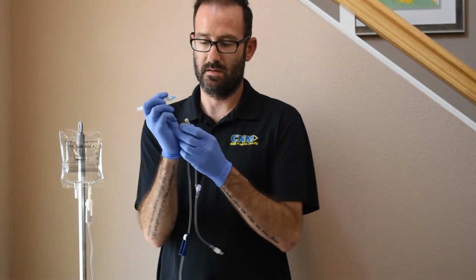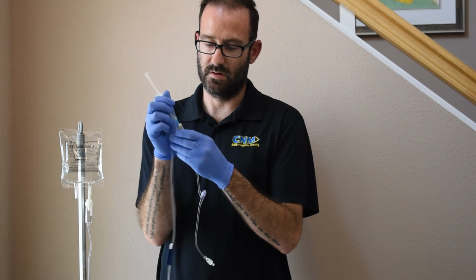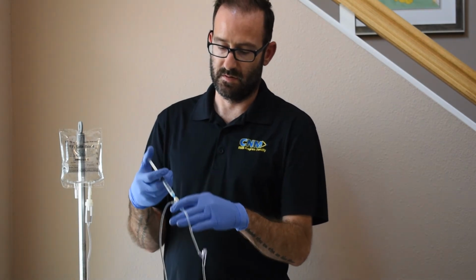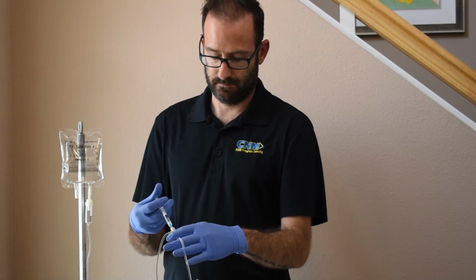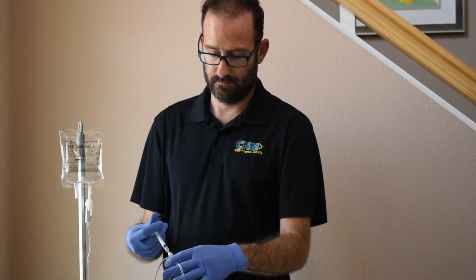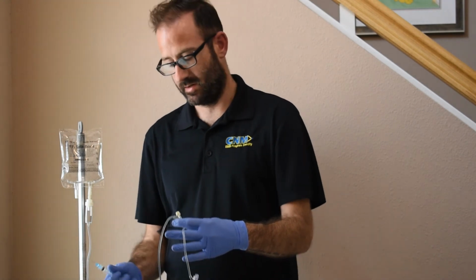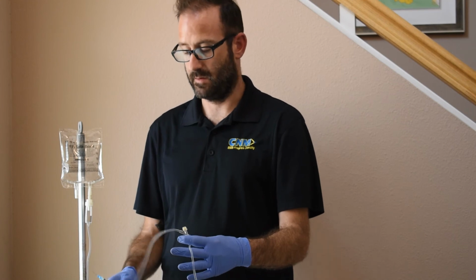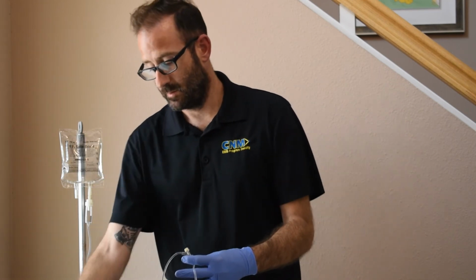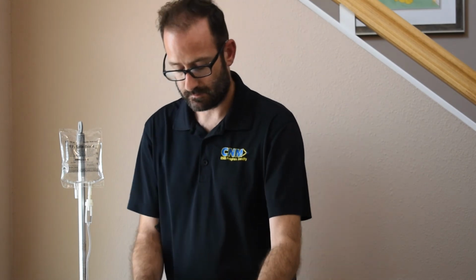I'm going to take my needle, insert it into the port, and then I'm going to go ahead and administer my medication. As soon as I am done administering the medication, I want to open up my line and allow it to flow again, and I'm going to immediately place my needle in the sharps container.